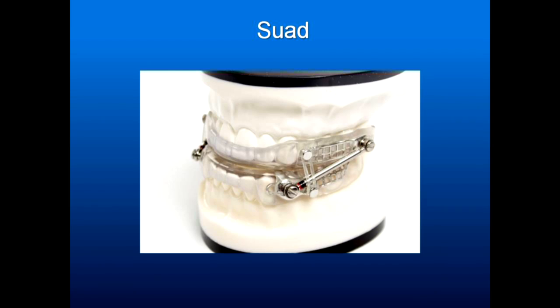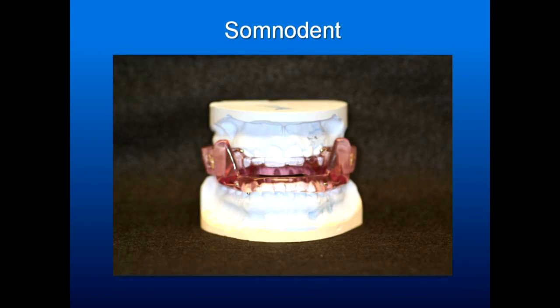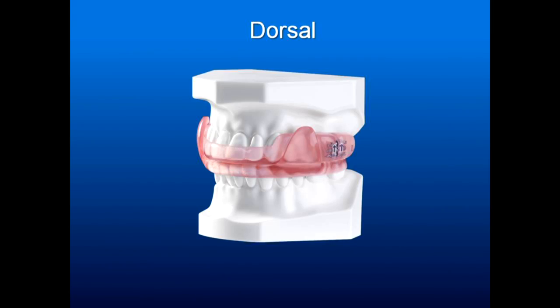Here's another look at it. Very well made appliance. Here is the type I tend to use, what's called the fin coupling appliances, where you have a fin on one of the members and a block that's pushed on the upper. The original design of this, well, it's not the original design, but the folks who really made it go were the Somnodent people. Somnomed, it's called the Somnodent appliance. This is the Dorsal appliance by another lab, and it's basically the same design. I like longer fins, and I like good, strong construction.